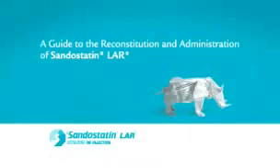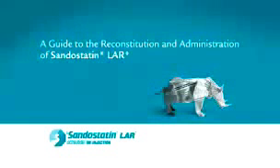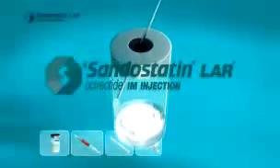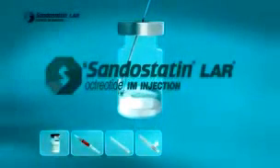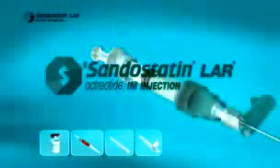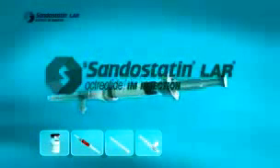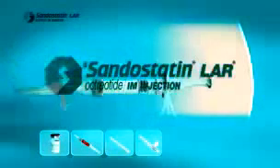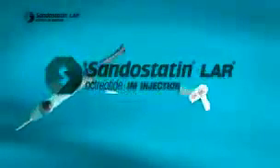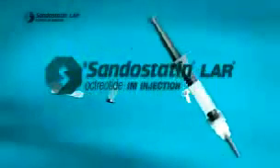This program provides you with a detailed guide to the required steps for the preparation and intramuscular administration of the Sandostatin LAR depot injection for your patients. Sandostatin LAR, octreotide acetate for injectable suspension, is indicated for acromegalic patients who are adequately controlled with Sandostatin administered subcutaneously, including those in whom surgery, radiotherapy, or dopamine agonist treatment is inappropriate or ineffective, or in the interim period until radiotherapy becomes fully effective.